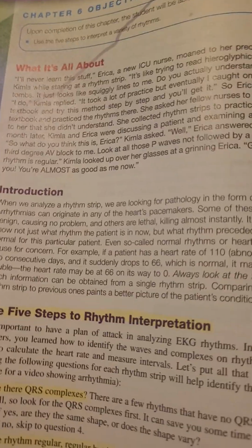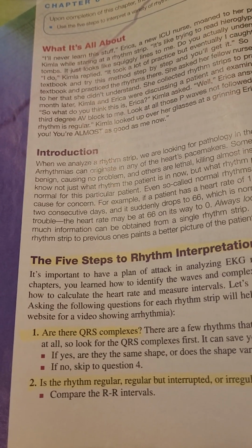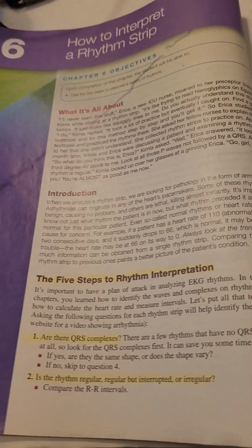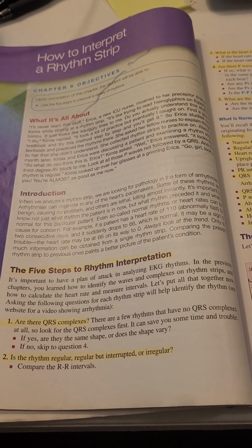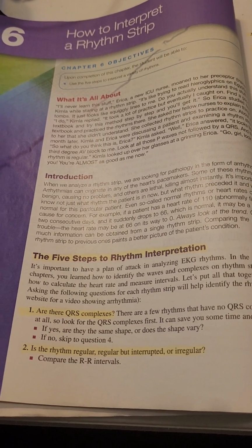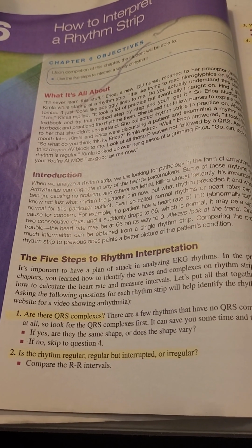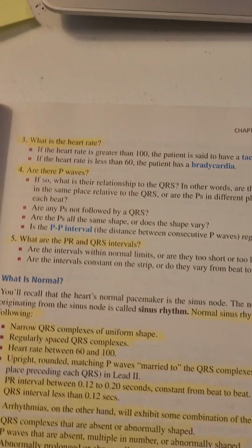Okay, so it says 5 steps to rhythm interpretation. Number 1: are there even any QRS complexes? Because some of them don't even have QRS, so you have to look out for that. Do they all look the same? Are they consistent, running consistently, the R to R? Number 2: is the rhythm regular, regular but interrupted, or irregular? Compare the R to R intervals. That's something else to look for.